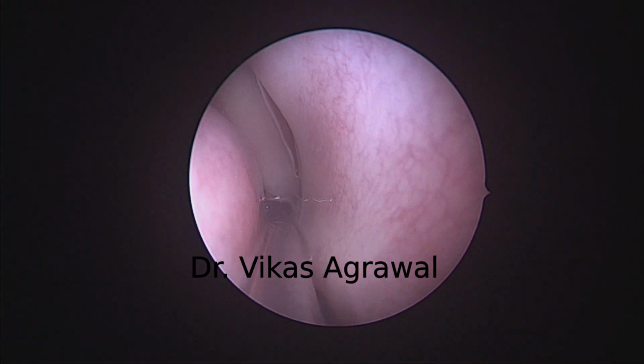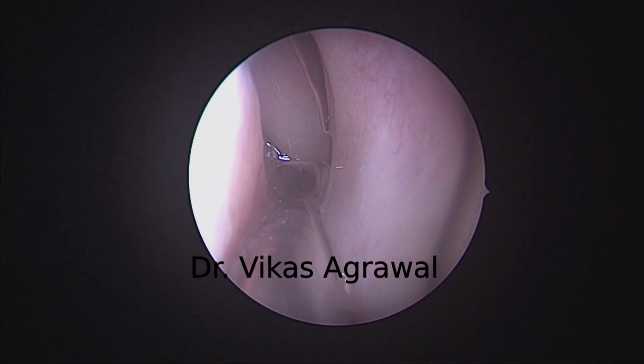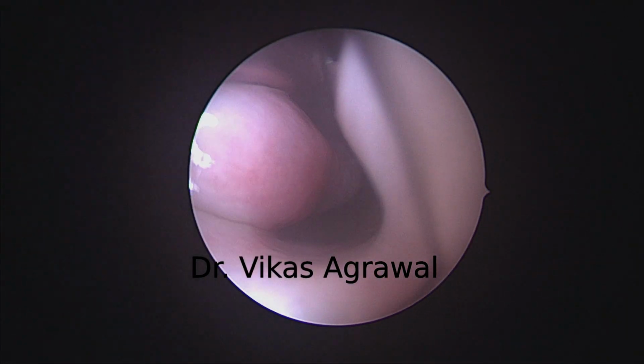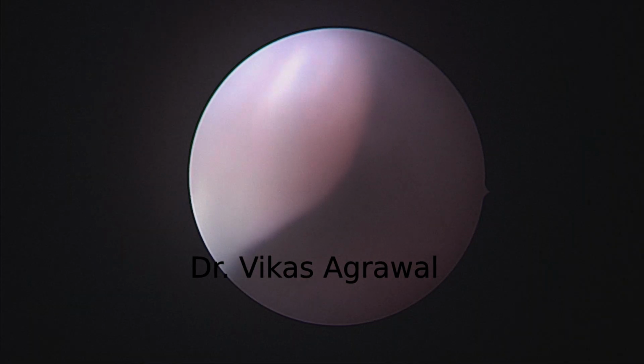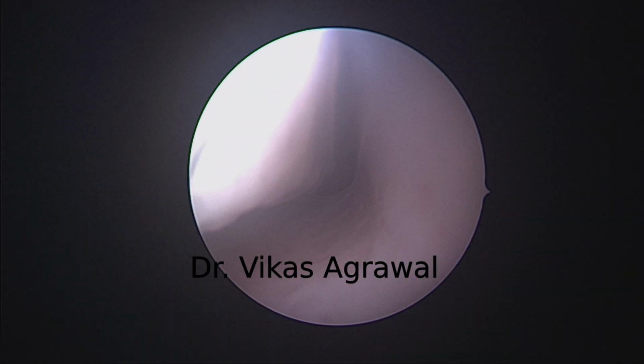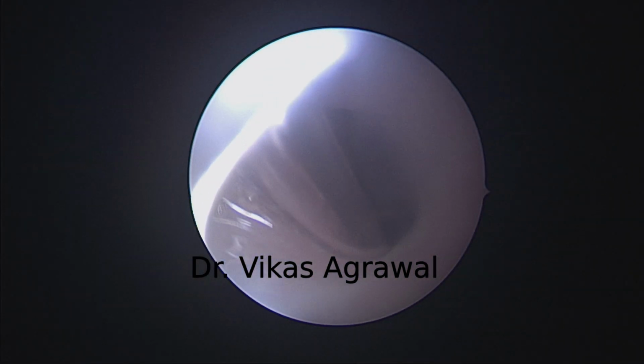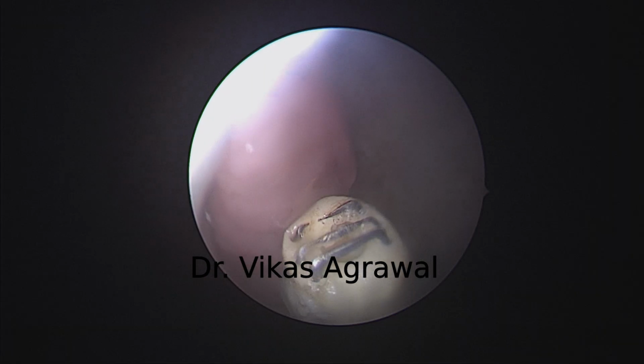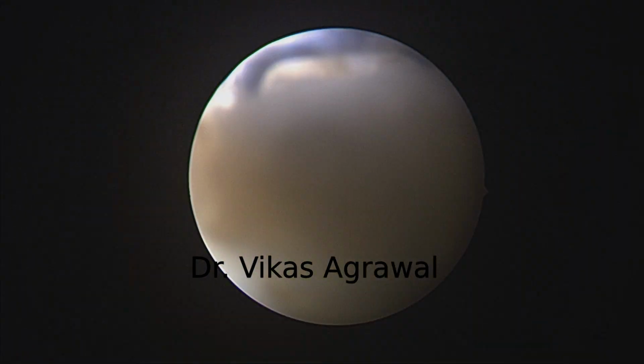There is deviated septum on the right side. I'm going to do DNS as well. Let me see if I have some space to reach below the DNS. Yes, I do have. I'll complete the adenoidectomy. Can you pour some water, sister? And you can see the wand is now getting exhausted.